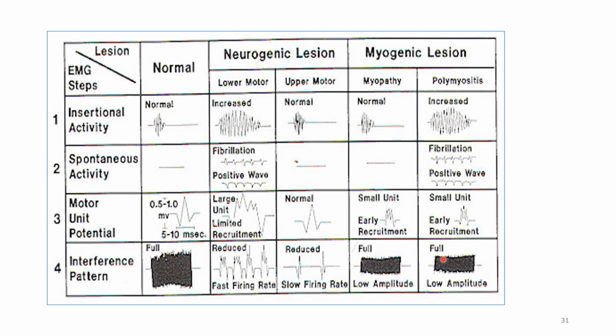And how normal EMG looks and how it will be studied under all these parameters; some 6 to 8 parameters are there. And next, what is the normal insertional activity, spontaneous activity, motor potential and interference pattern, all these things you have to study, and you have to practice these diagrams. And we have also learned what the fibrillation potentials and fasciculation potentials are.